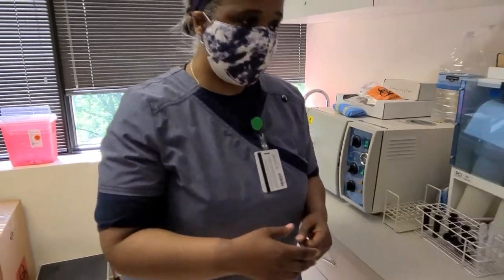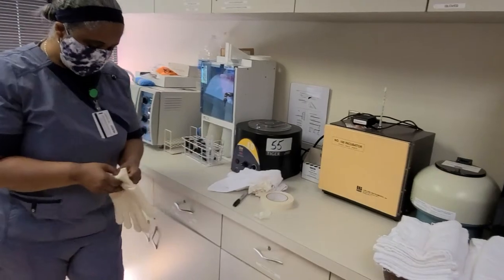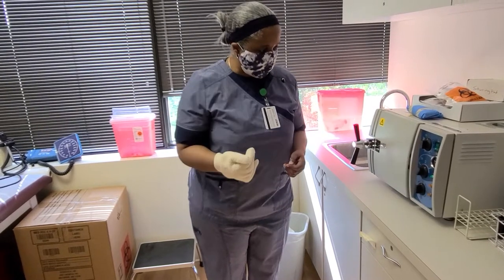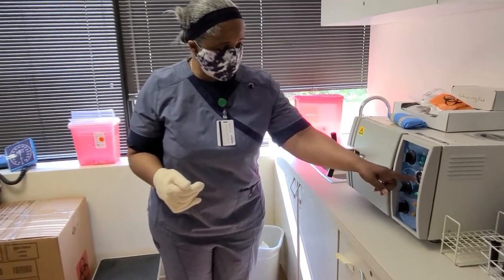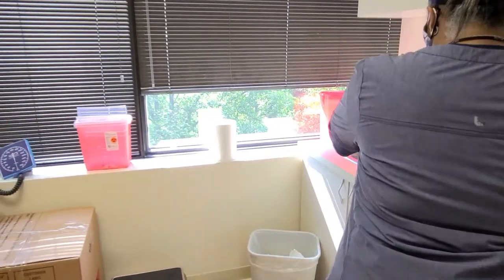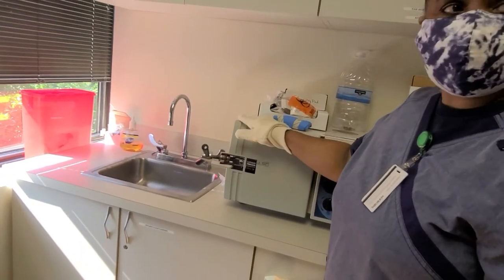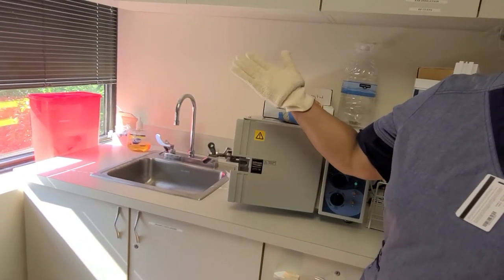Then I want to get a utility glove, because I don't want to touch the instruments, and I can have one or two. After it's decompressed, I'm going to watch that needle move down. I'm going to stand on this side and open this up. When I open it, I'm going to open it using my utility glove only a quarter of the way, because the steam is going to come out and you don't want to get burned.